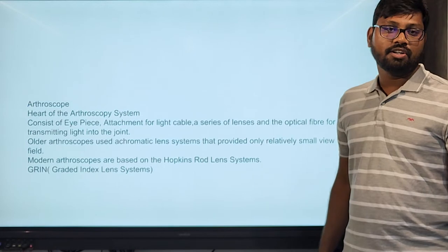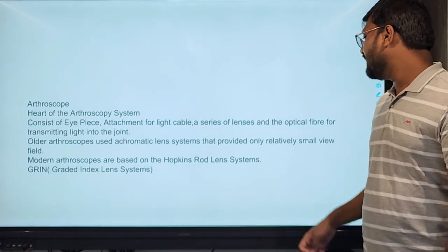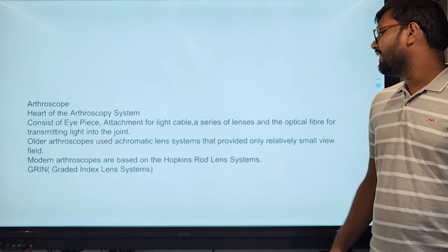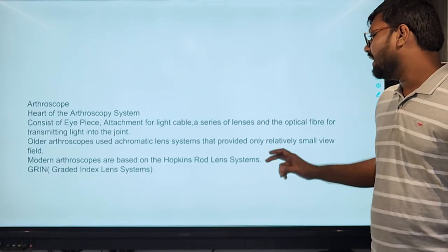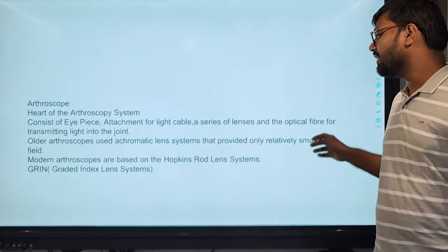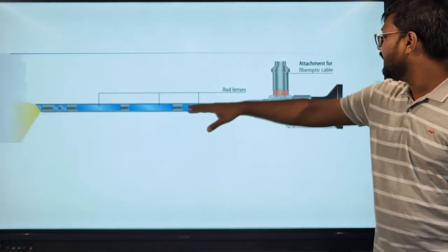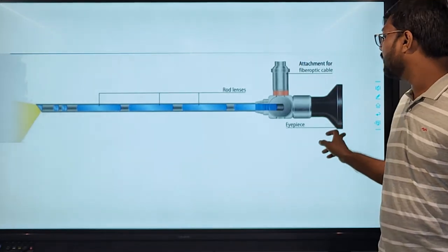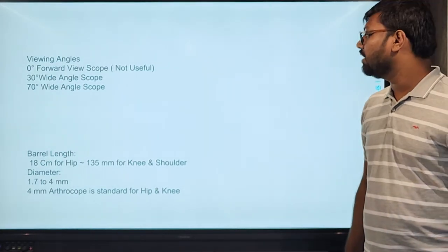The arthroscope is the heart of the arthroscopic system. It consists of the eyepiece, attachment for the light cable, a series of lenses, and the optical fiber for the transmission of the light. The older arthroscopes used achromatic lens systems that provided only a relatively small field of vision, and modern arthroscopes are based on the Hopkins rod lens system and the Grin graded index lens systems. This is the arthroscope with the rod lens, the attachment for the fiber optic cable, and the attachment for the eyepiece and the camera.